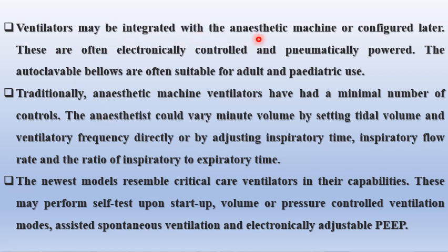Ventilators may be integrated within the anesthesia machine or configured later. These are often electronically controlled and pneumatically powered. Traditionally, anesthetic machine ventilators have had a minimal number of controls. The anesthetist could vary minute volume by setting tidal volume and ventilatory frequency directly, or by adjusting inspiratory time, inspiratory flow rate, and ratio of inspiratory to expiratory time.